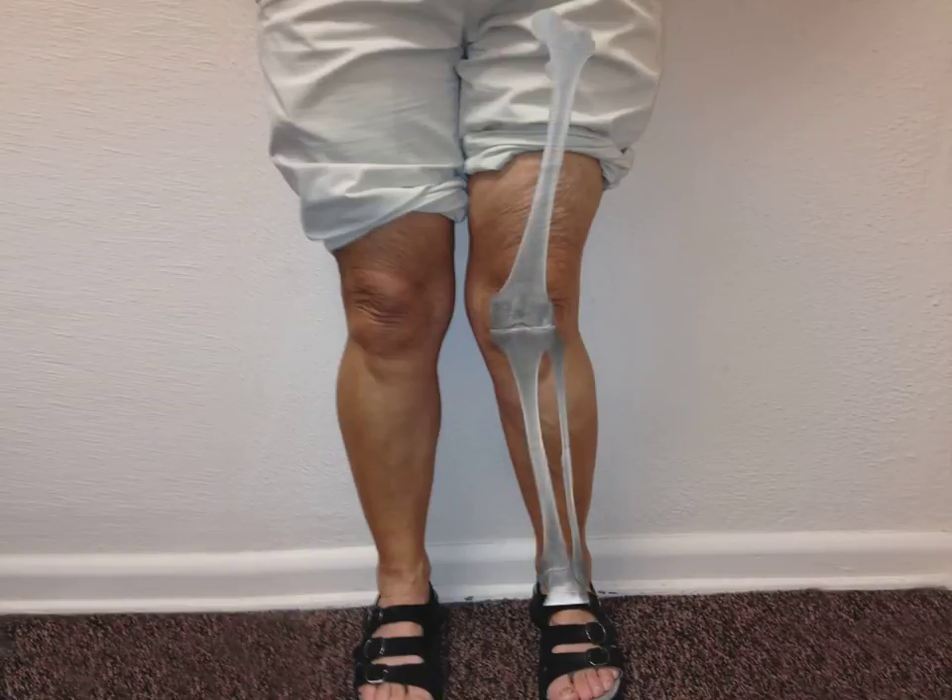Here is the x-ray of Mary's whole left leg. As I draw a straight line from her hip to her ankle, notice how Mary's knee sits significantly to the inside of this line. Before she had developed arthritis, Mary's knee was positioned directly through this line. The years of arthritis have caused her knee to move out of normal alignment.